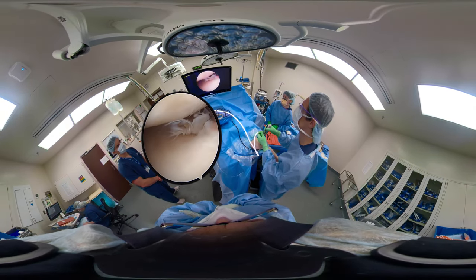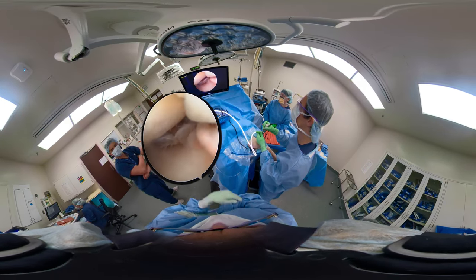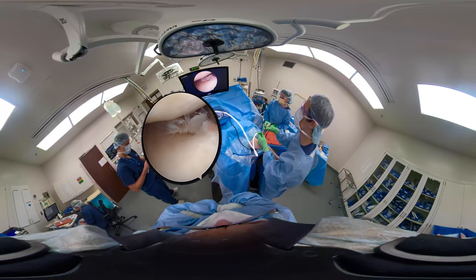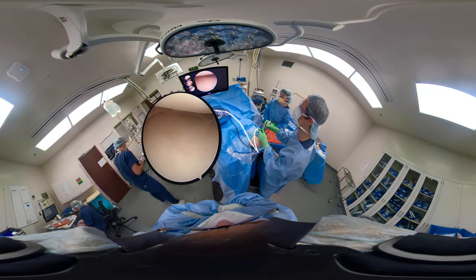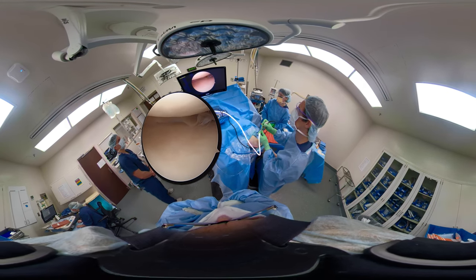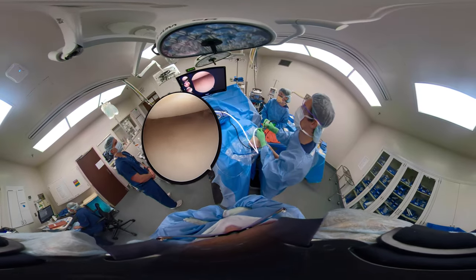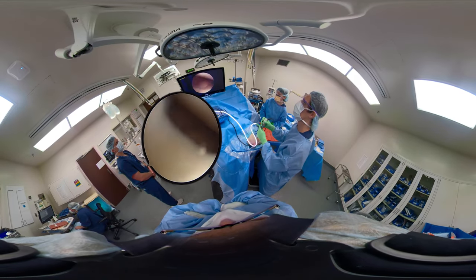You can see there's a little fragment of the meniscus that's flipped up in that posterior horn. So that's consistent with his exam, MRI scan, and complaints. We can see that we have a medial meniscus tear, posterior third. Medial femoral condyle looks pretty good. Take a couple pictures and then we're going to establish our medial portal.